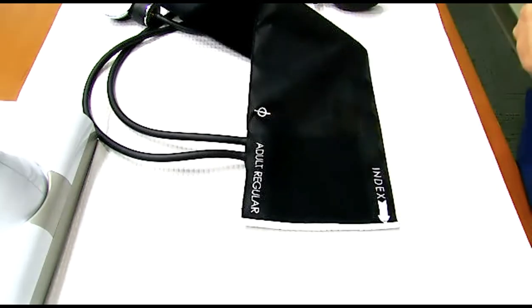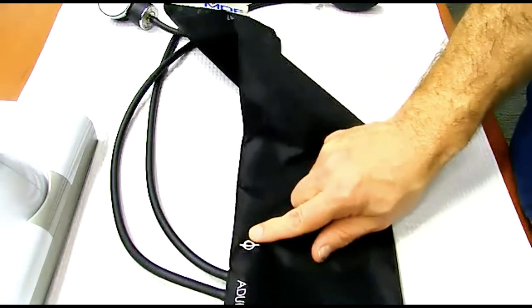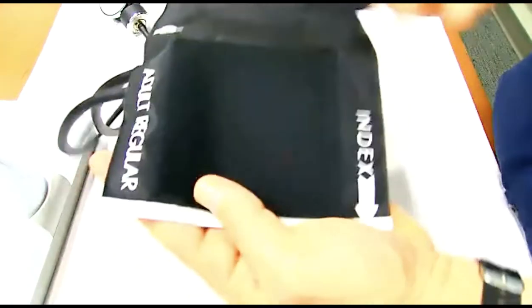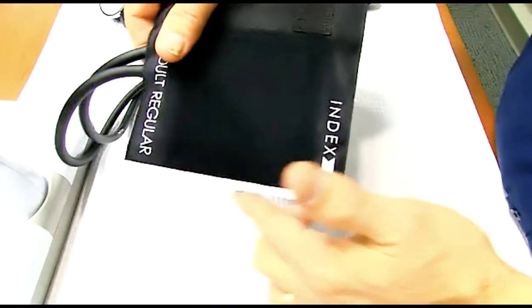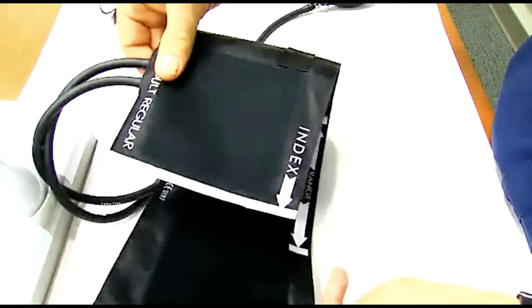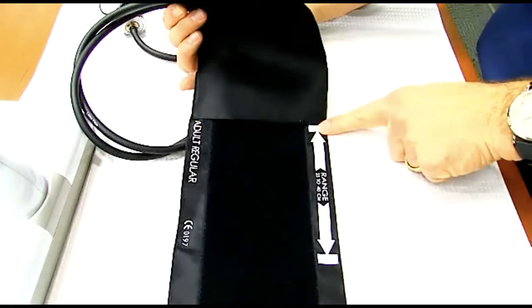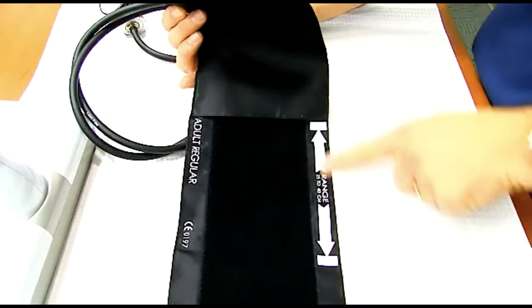So let's follow up on that. How do you know if it's appropriate? Well, remember how we said we know this is the outside of the cuff because of the line with the circle. Okay, so if I lift that up, look over here, you can see on the very edge of your cuff, it's got this white line. If you hold this up, and then if you pull the cuff around, normally you're going to wrap this around the patient's arm. You'll notice on the inside, there's this range. It's got an arrow with the range. Okay, that's really the only main thing printed on the inside.